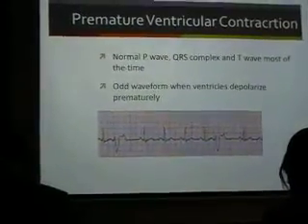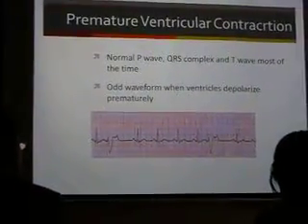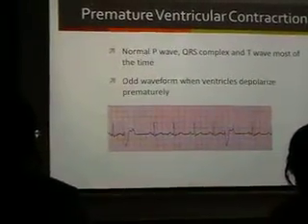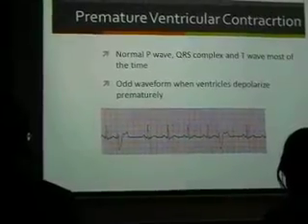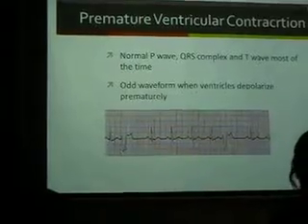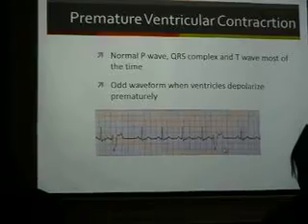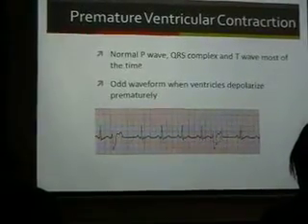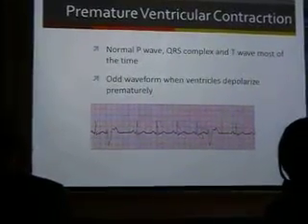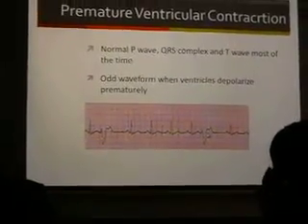You may have had this experience if it feels like, oh my gosh, I have an extra weird heartbeat in there. It might have been an ectopic focus with a premature ventricular contraction. This one goes down because it's probably on the left side of the heart. Depending on where it is, it may go up, maybe an extra something that looks like a QRS. But because you're looking at the other side of the heart, don't worry about that. If you see something that doesn't follow the normal PQRST, and all of a sudden you have an extra in there, then you might have a premature ventricular contraction.